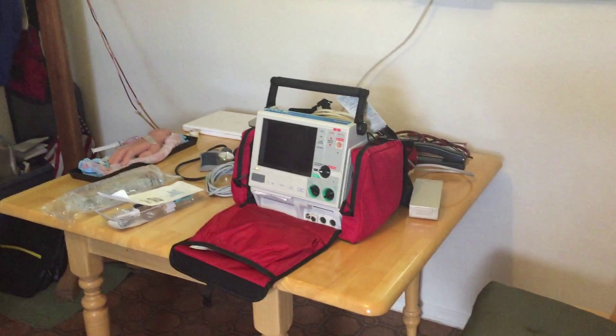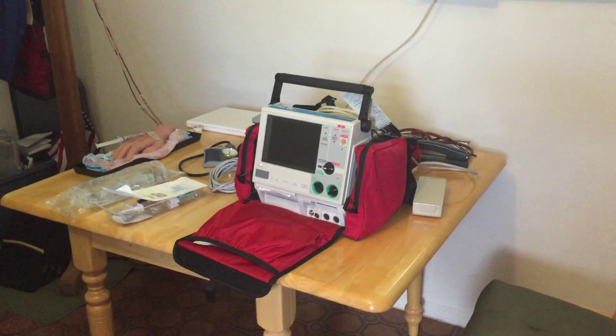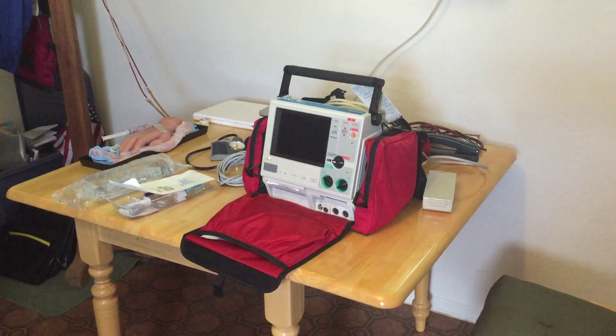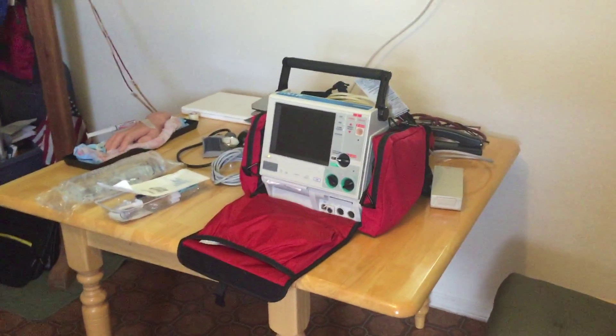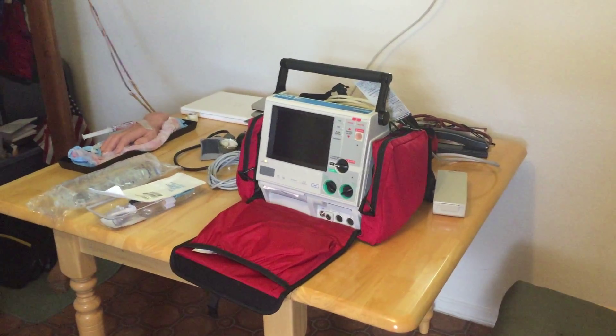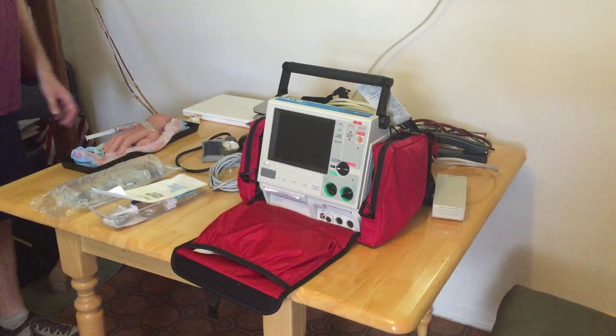Hey everyone, this is Chris with the Ancient Scholar. How you guys doing? I'm going to take you through another video here real quick, and this is going to be a follow-up to all the hemodynamics videos I did some years ago. What I'd like to do is take you through setting up a hemodynamic or an invasive line. So I have simulated an invasive line here.